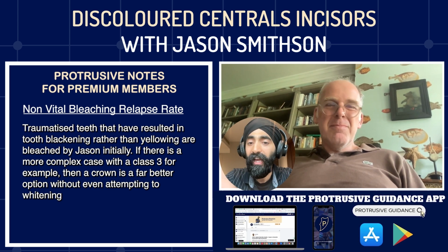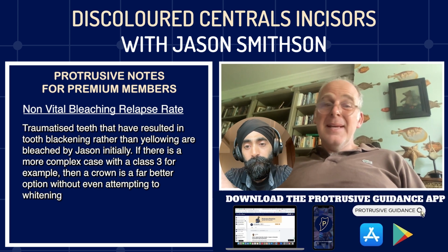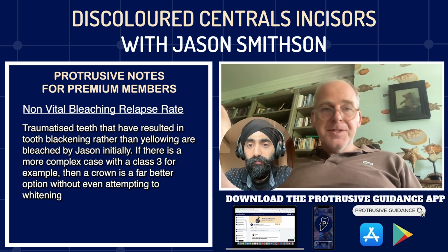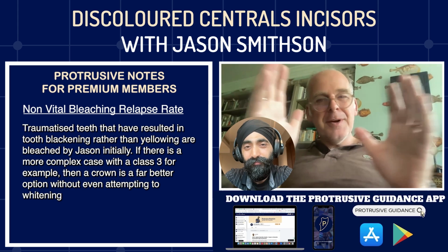Because it's already... and pretty skip the whitening, right? Skip the whitening, yeah. I'm going to do a crown with probably a post, but no prep of the post space. And they're the two extremes. So you've got the really minimally damaged tooth and you've got the maximally damaged tooth. The nuance comes when it's somewhere in between.